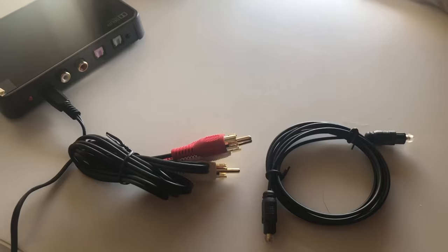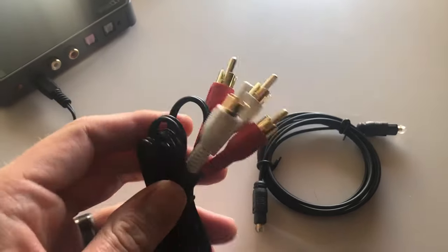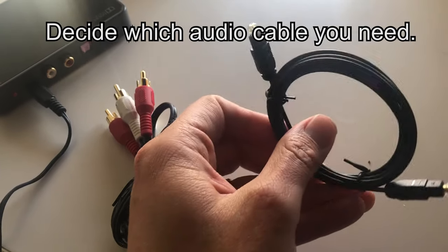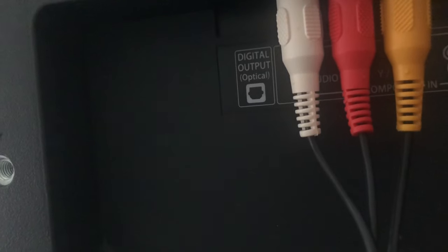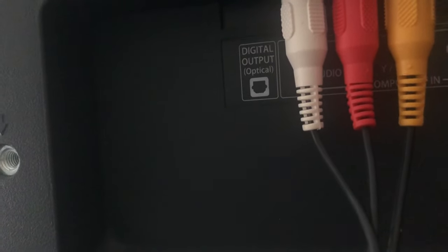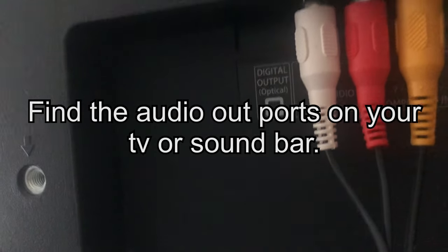First, decide what kind of plug you're going to use — whether you're going to use the auxiliary plug or the toslink optical plug. Look on the back of your TV or on the side of your soundbar, wherever the audio out connection is — that's how you'll determine which cable you need. You could use either aux or the optical out, which is the toslink.